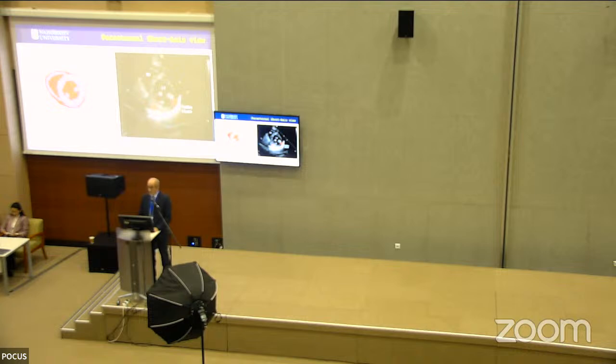What is also important is to look at the ventricle in the short axis, because this view allows you to have the full assessment of all the left ventricular wall from the mitral annulus level until the apex. So it will give you a very good idea about not only the global, but also the regional function of the ventricle.